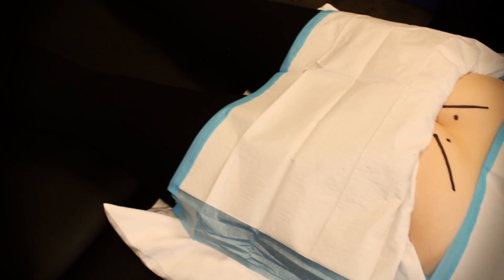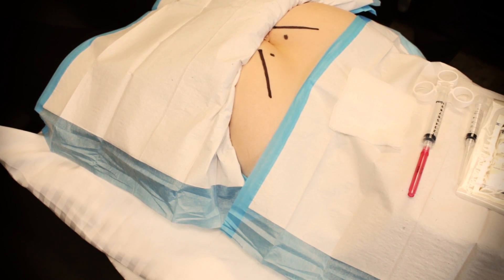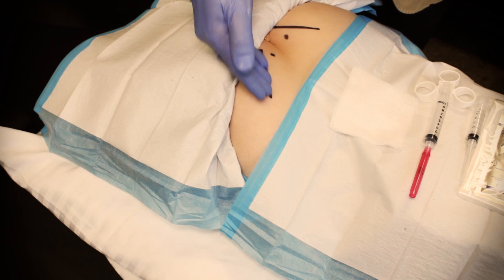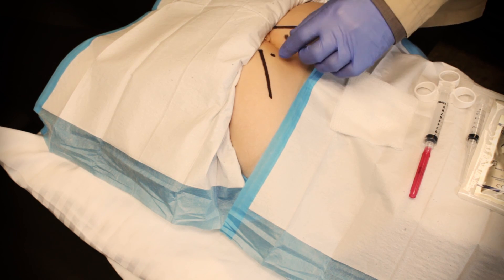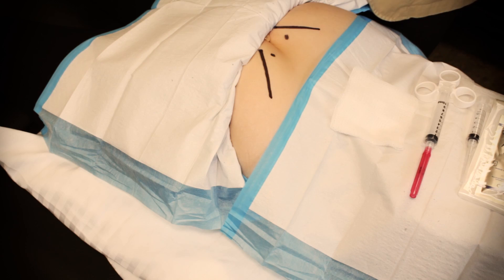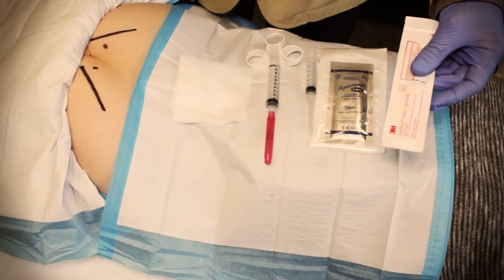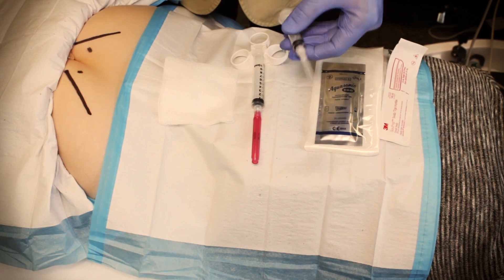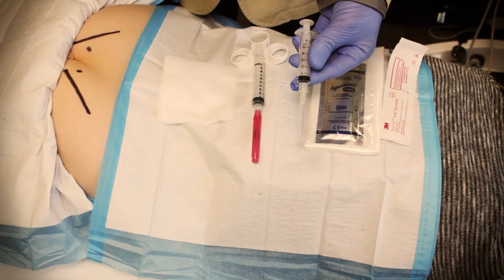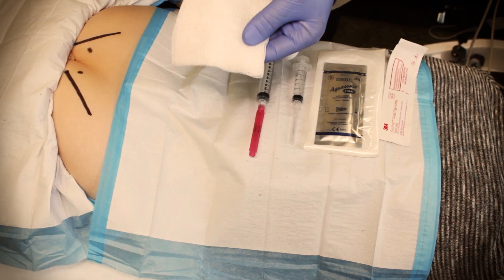Caudal epidural injection is done in a prone position. Patients are placed comfortably on their front with a bolster underneath the hips. The area is draped and lateral sacral margins can be marked in the approximate location of the sacral cornu. Equipment needed includes cleaning solution, sterile gel, needle and syringe for anesthesia, needle and syringe for the epidural, and gauze for after.